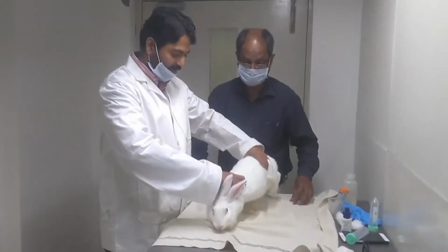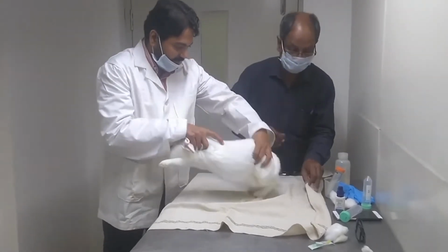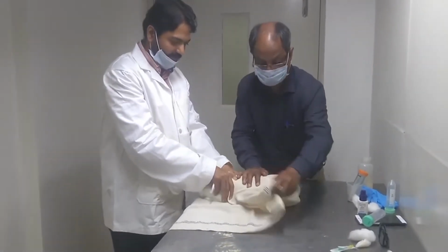Now we will restrain the animal on this cloth. We will keep the animal relaxed on this cloth and we will restrain it.